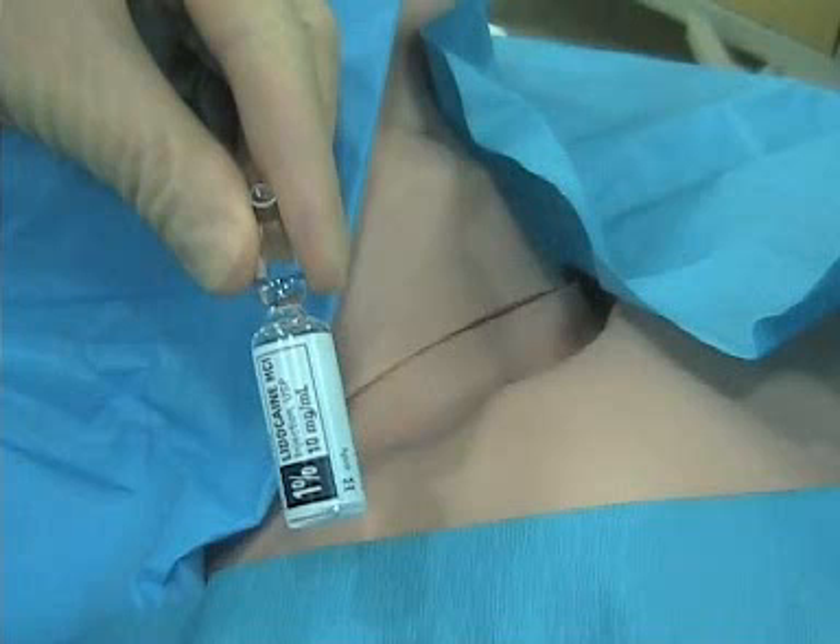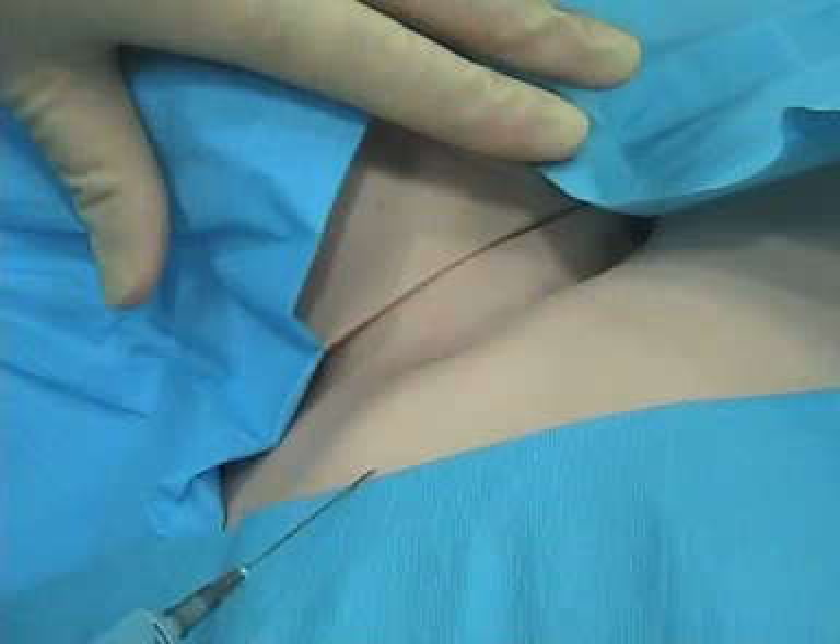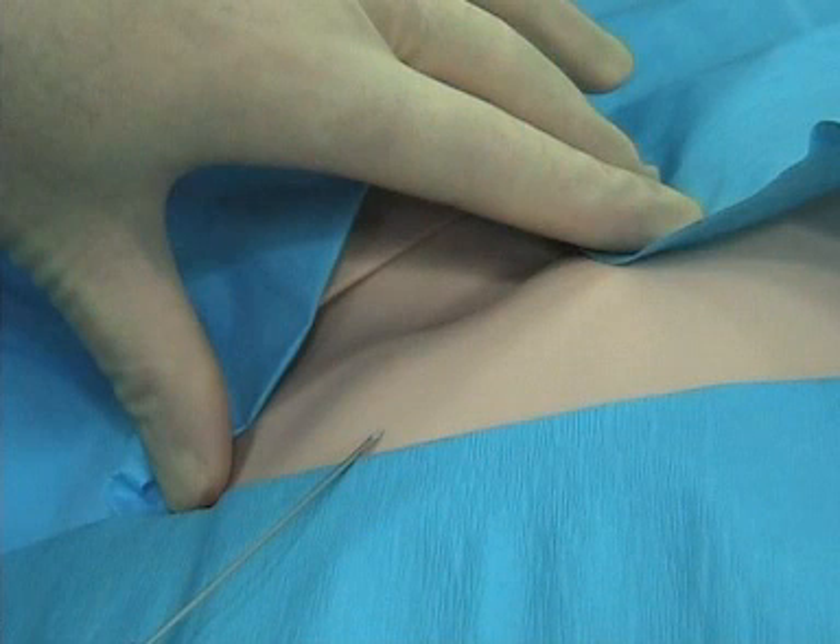So let's show it the real way with needles. You notice I'm gloved up now. There's a little lidocaine — this hurts, of course, so put a little local in. Here comes my needle where I'm putting a little bit of local, and now it's time to do the stick.